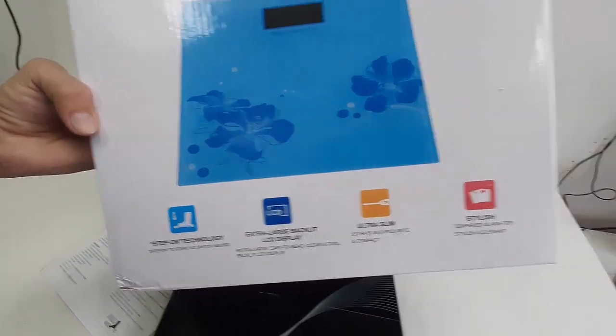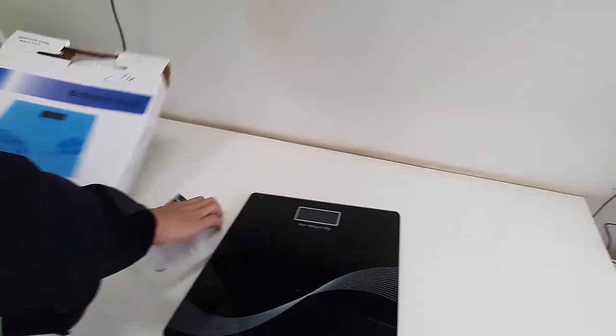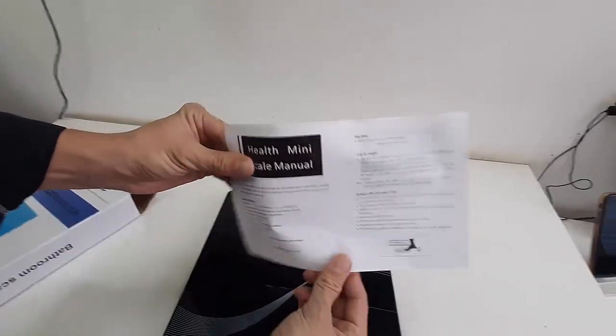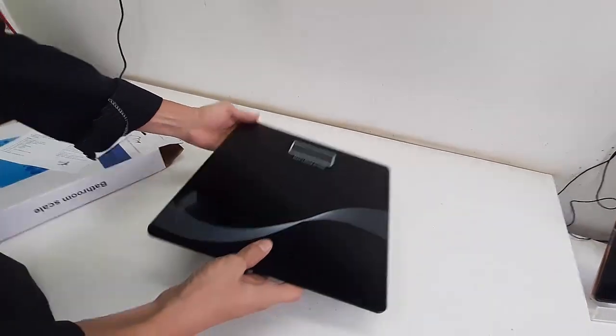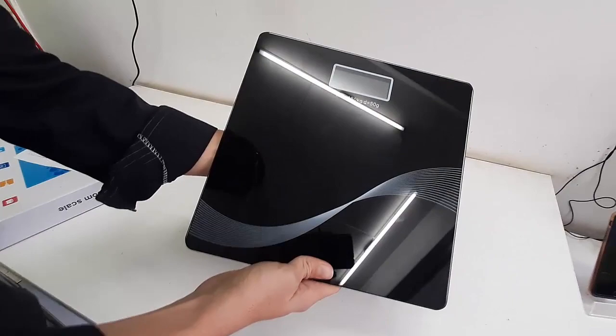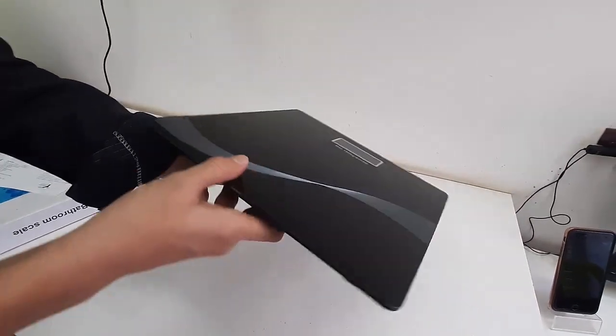On the large digital display you will get the weight measurement, room temperature, and battery indicator. This is the user manual. The color combination is nice and the design and build quality are good.